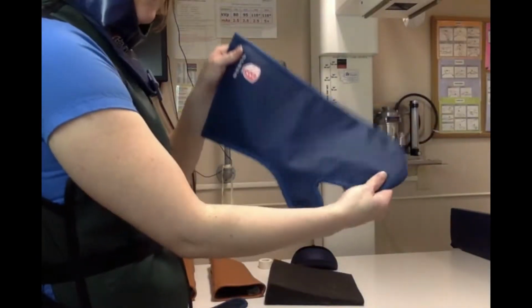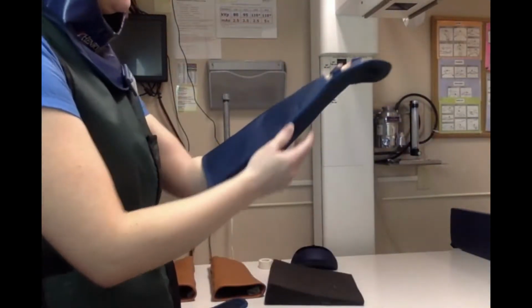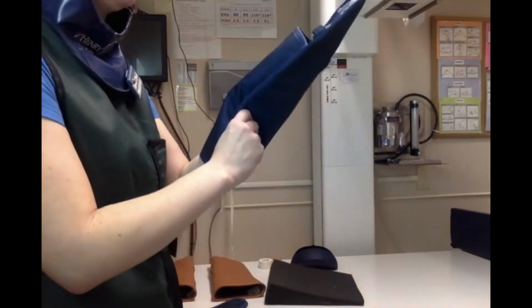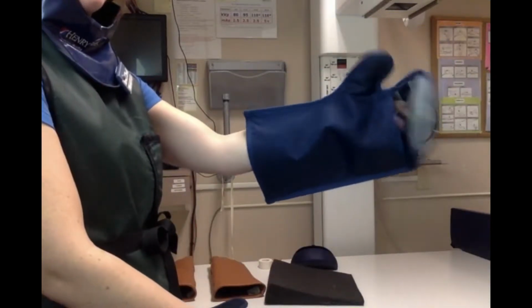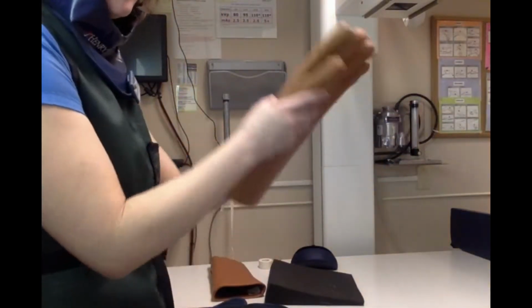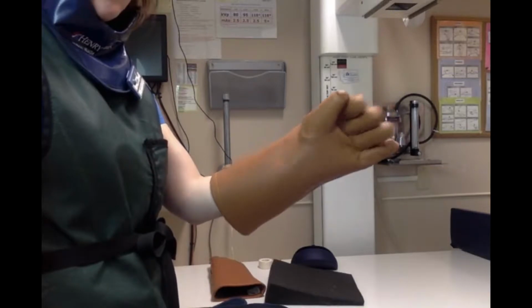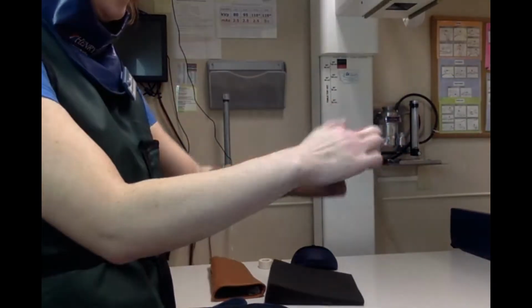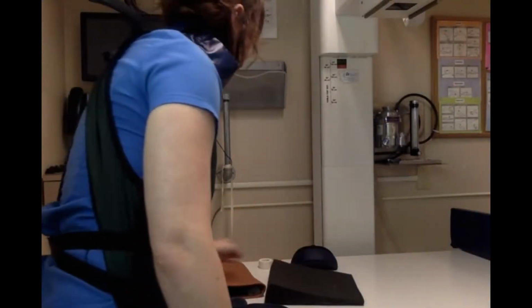I particularly like these gloves. You can stick your hands in them. They have little loops for the fingers, so you can have your hand out to secure a patient or hold on to it this way. I can also stick my thumb all the way in here if I need to be able to move it around. We also have, we call these Gumby gloves, that give you a little more movement with your fingers, but they are a little bit stiff because they're lined all the way around to protect us from any of that scatter radiation coming off of patients.